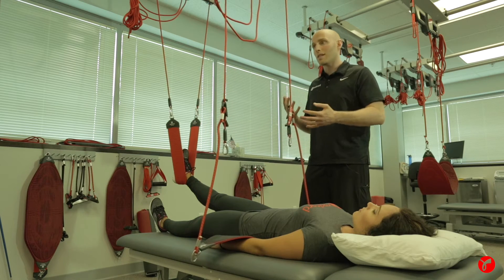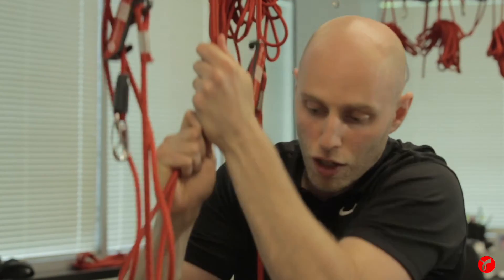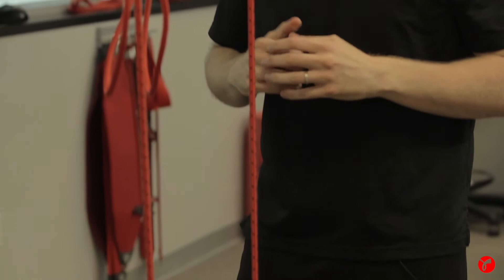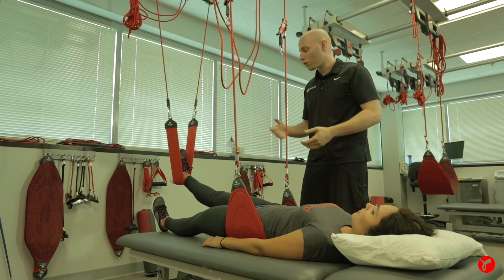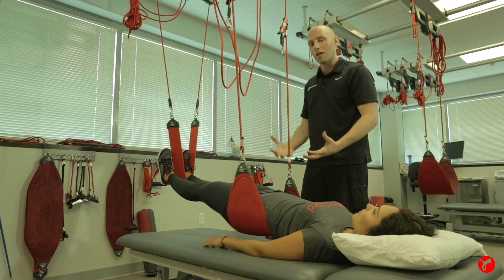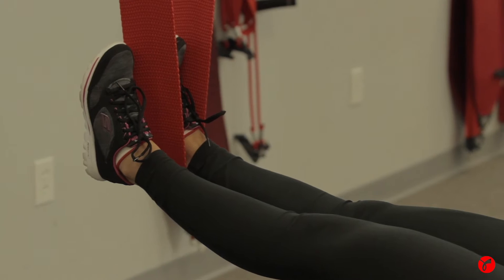The way that I add the assistance is I have to make that line taut. I'll pull down on the ropes and give it a good pull — you can see how that stretches out the elastics. Now the elastics want to rescind, so that is going to result in helping her get off the ground — the lift off. So the bungees are actually pulling her pelvis up in the air and assisting, giving some off-weighting.